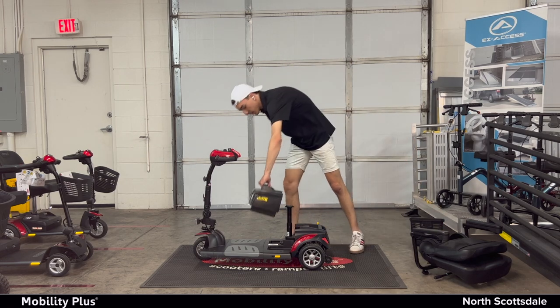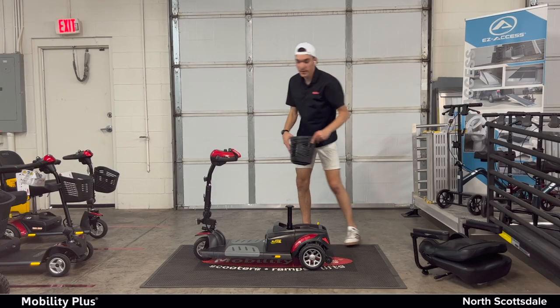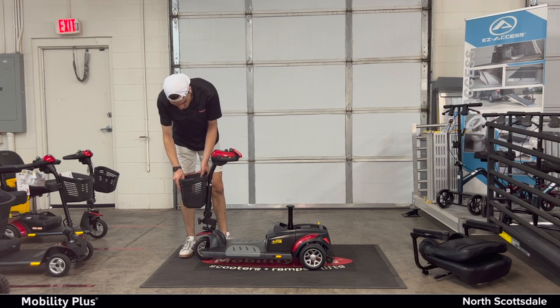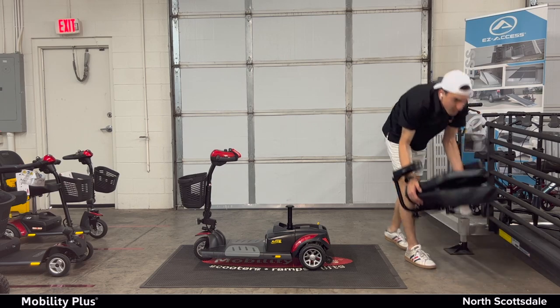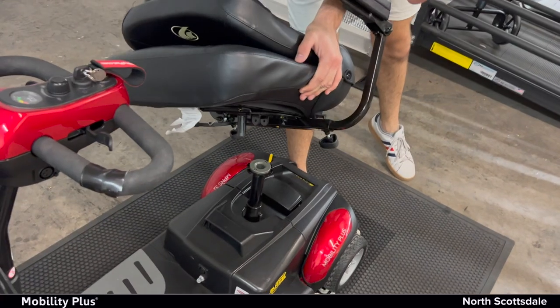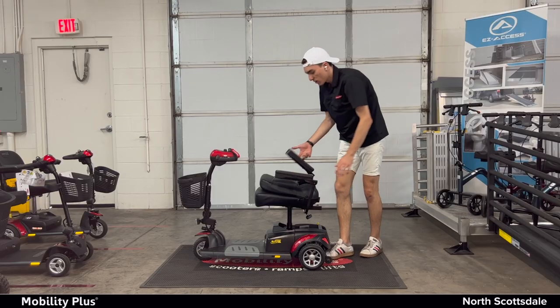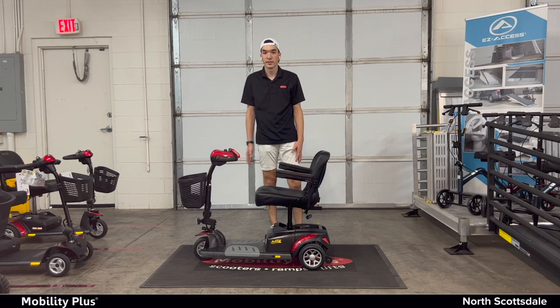Battery just goes right in. And then of course the basket — just goes right into the front. And finally the seat. What I recommend is to hang it from the sides if you can, that way you can get a better angle. Put it right into the hole and then lift it back up. That's your scooter all assembled and you're ready to go.